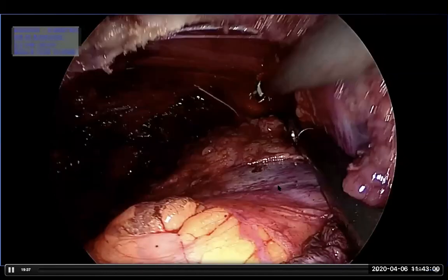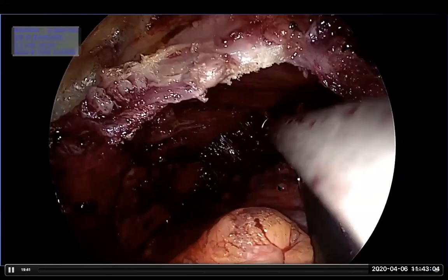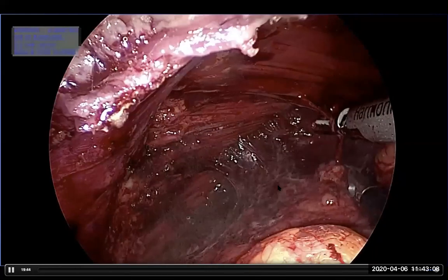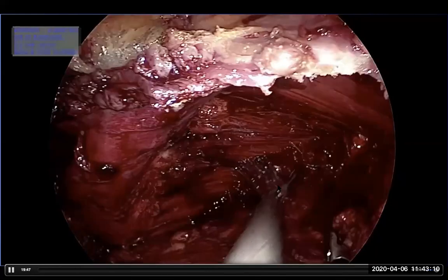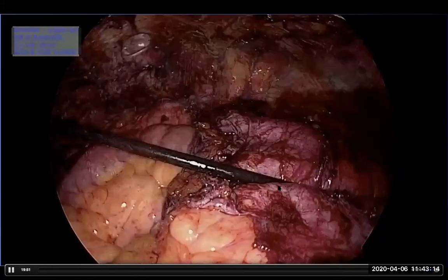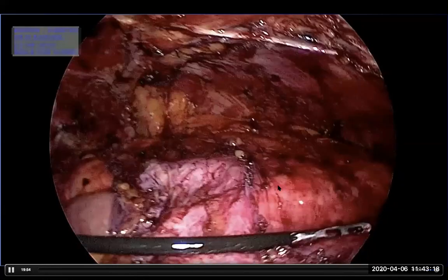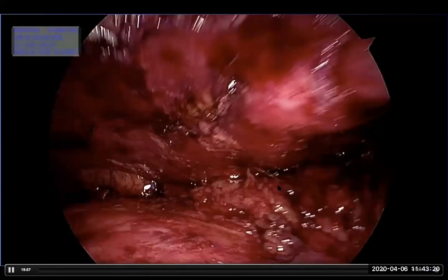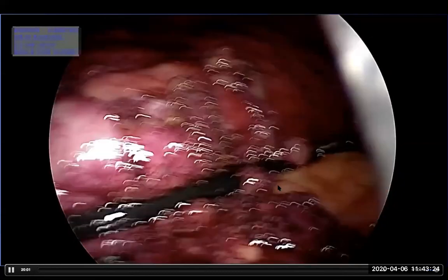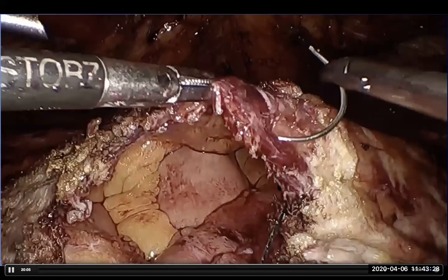And underneath the ribcage, you get the diaphragm and you stay in that preperitoneal plane under the diaphragm. Sometimes this tends to ooze, especially in bilateral TARs in a difficult procedure. No problem. Your picture will temporarily become darker. So put in gauze pieces, soak up the blood, suck them out, and start again. Your picture will improve.